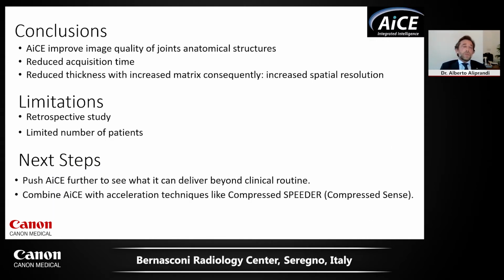To conclude, scores of clarity of visualization of anatomical structures were higher for the AiCE protocol compared to those for the standard sequences, although that was not our primary goal. We also obtained decreased acquisition time and of course increased spatial resolution.